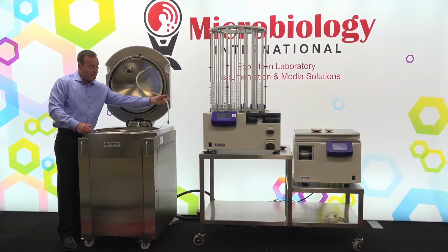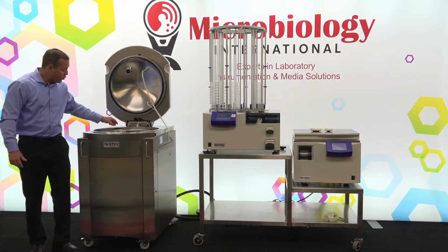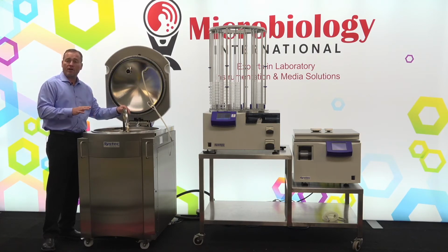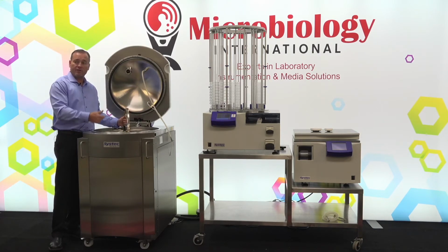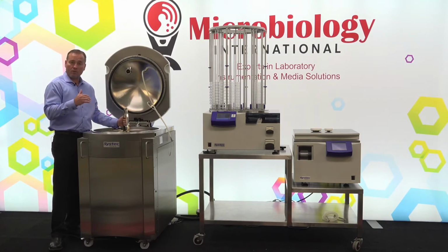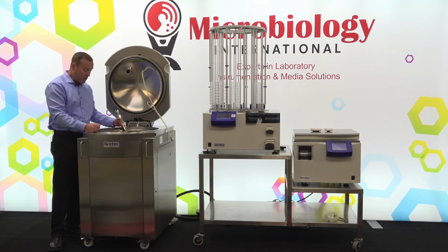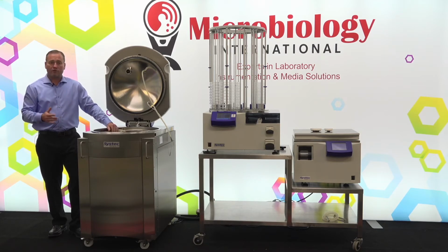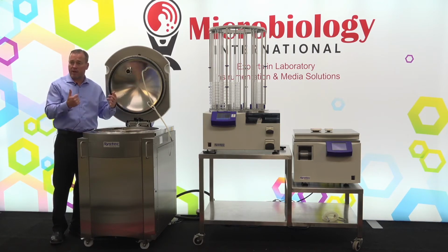There is also the capability of adding a lift to this unit if we would like, that can be located on the side, so we can attach that to here to remove any of the empty vessel or a vessel that may have a bit of media left in it. It's not designed obviously to lift this full, only designed for labor-saving device to make sure that we're not lifting this bucket up and out of there all the time. We have a lot of customers that utilize the MediaPrep 120s. Probably about 30% of them do utilize the lift that would just attach to the bale to be able to lift this out of here, but many folks just use these and just lift them out on their own.